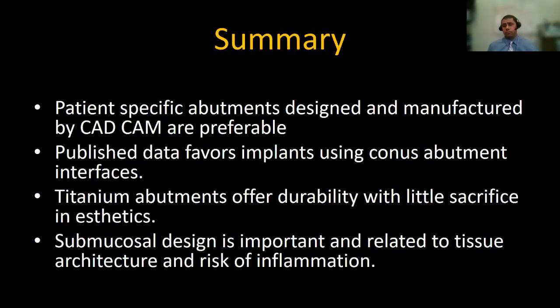So in summary, as we come to the end of this overview of implant abutments, patient-specific abutments actually provide huge advantages for the patient. They are designed and manufactured by CAD/CAM technology. They are preferred because they provide a huge advantage from support of the soft tissue, control over the emergence profile, and providing huge aesthetic and functional advantages for the patient.